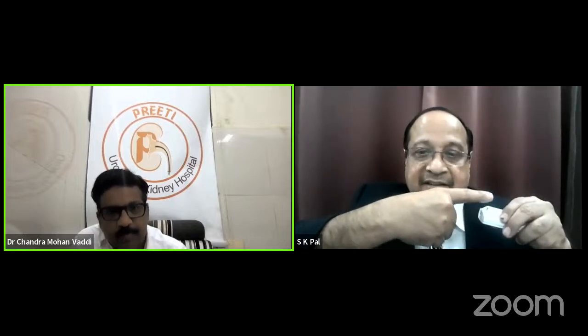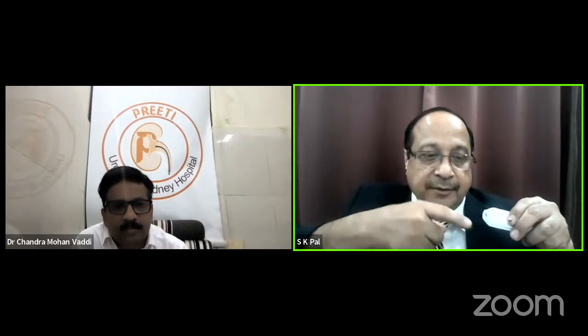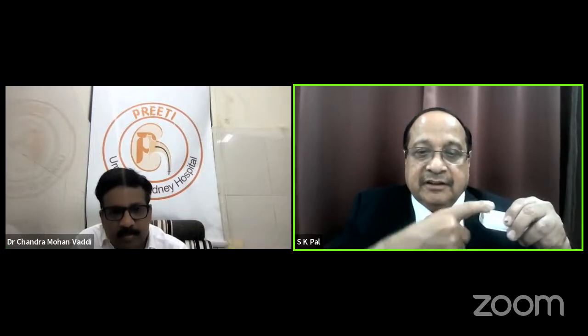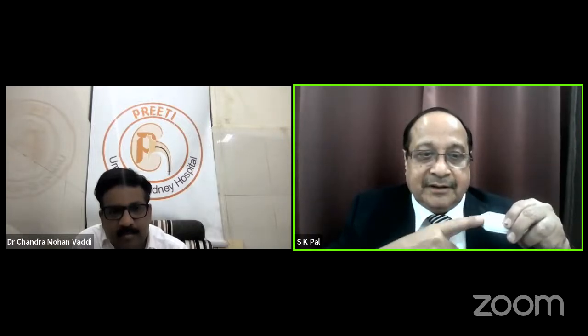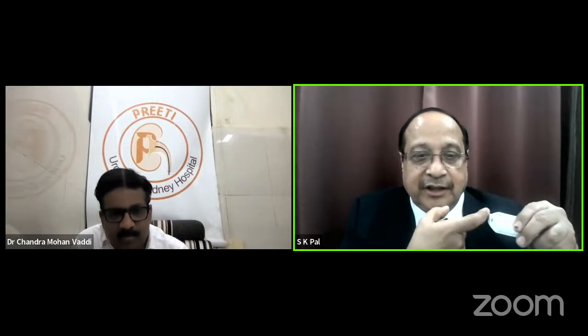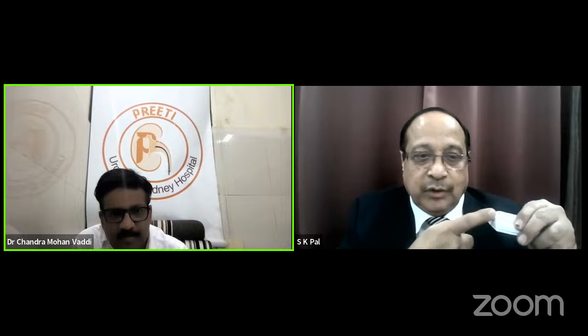The system should be nicely distended. When it is distended with the 20 ml saline syringe from below, I'll put this down, the needle hub will go down, and then I try to glide either a Terumo guidewire or a zebra guidewire. The J-tip will not go at times and will slip over. At times, nothing works. When you are pushing again and again, you will make some false track here or there.